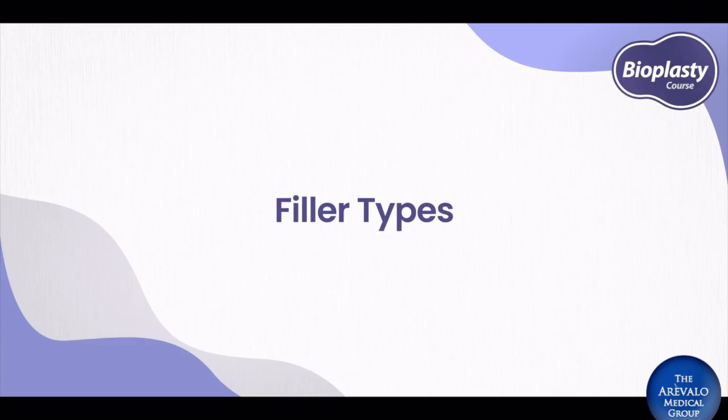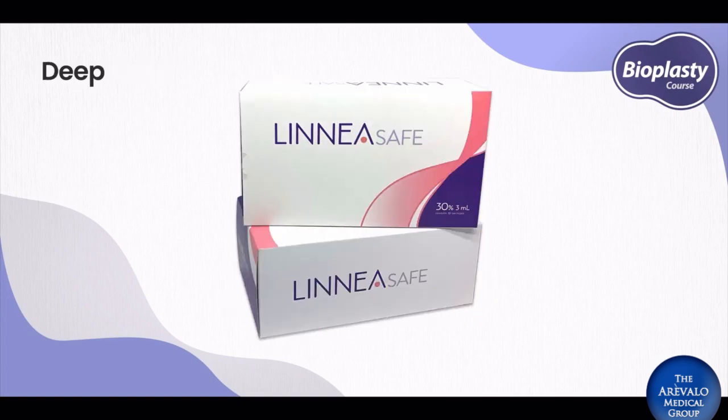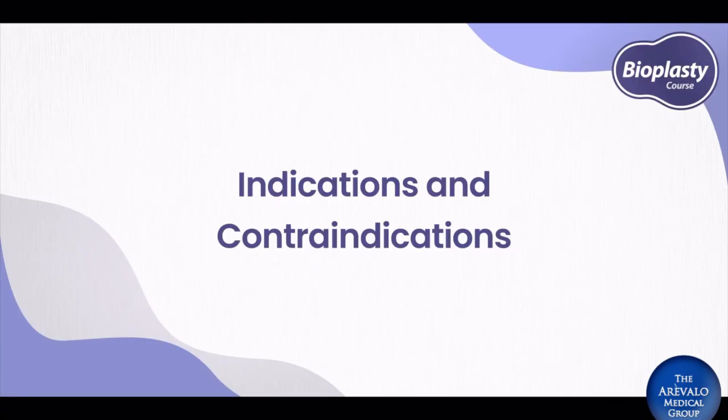Now let's talk a little bit about the types of filler that can be used to correct the gluteus. LineaSafe 10% 1 ml is used for small superficial corrections. LineaSafe 30% 3 ml concentration is the ideal product to increase the volume of the gluteal region in deep levels. As with any aesthetic procedure, there are indications and contraindications that we must observe.